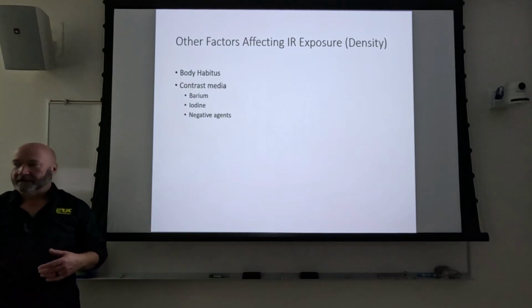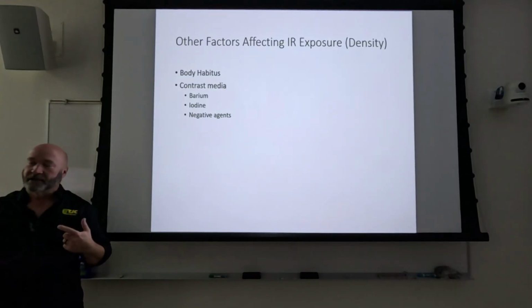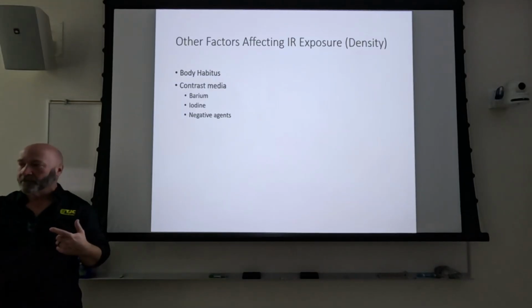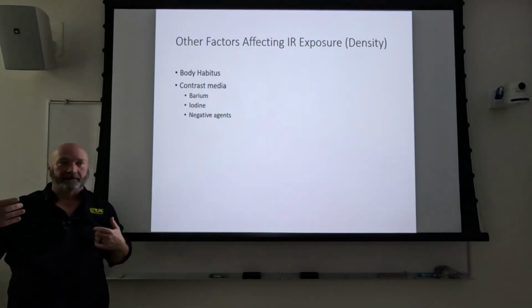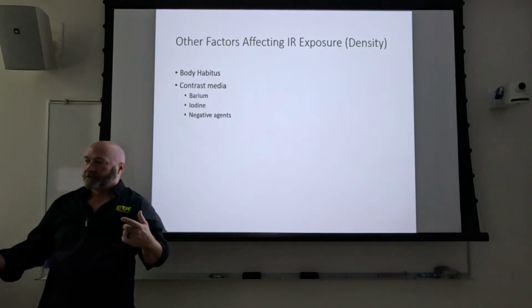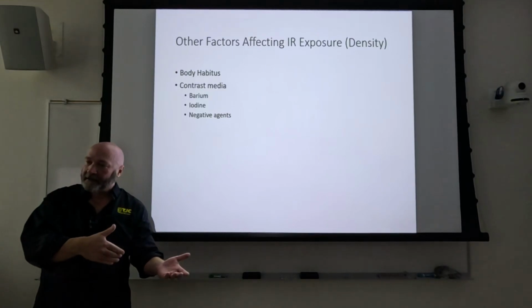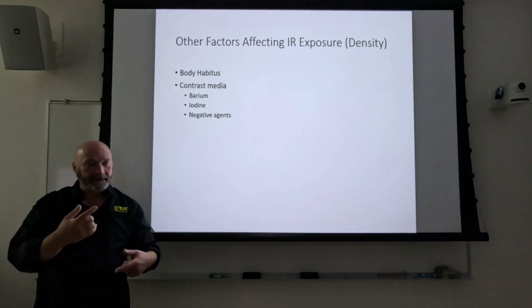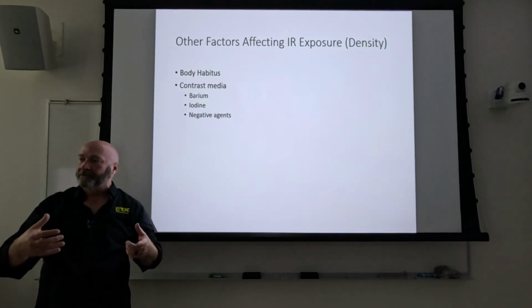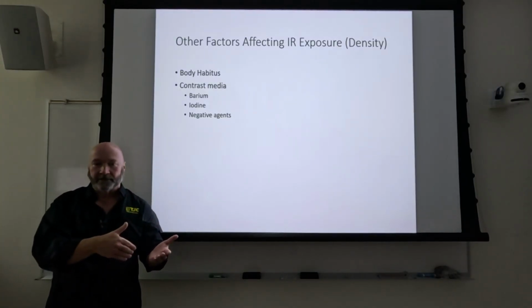If they're doing a C spine, they might inject the one with a higher number, which reflects more iodine in the solution, so that when they tilt the patient up and it runs up into their neck and mixes with all that CSF, there's still enough in suspension to get into the C-spine that they can make the diagnosis, okay?